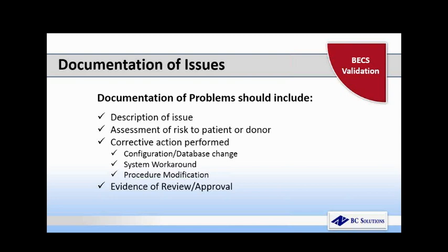It's inevitable that during the course of the validation you will discover some issues or problems in the system. There may be things that are not working exactly as you want them to work due to system design. There may be times when the expected response and the actual response of the system in a certain situation did not work. There may be runtime errors. There may be other errors, when the system fails to respond as it should.